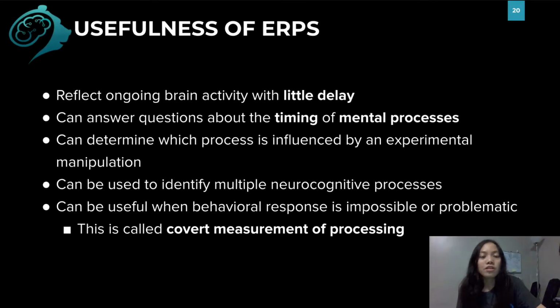So overall, the N170 example illustrates the precise temporal resolution of the ERP technique. ERPs reflect ongoing brain activity with little delay, and an ERP effect observed at 150 milliseconds reflects neural processing that occurred at 150 milliseconds. Therefore, ERPs are useful for answering questions about the timing of mental processes.